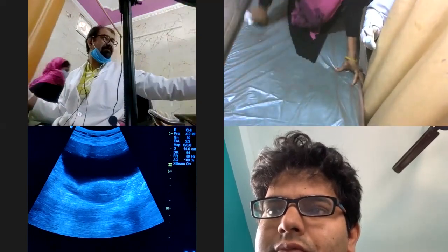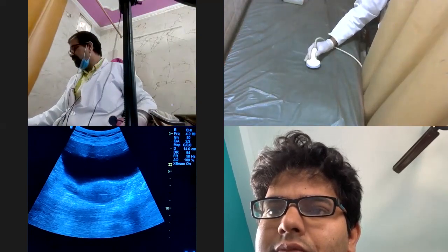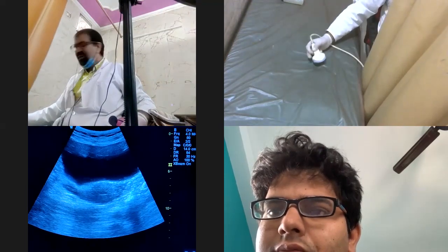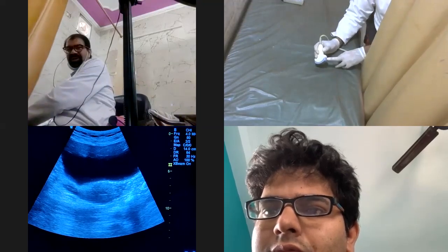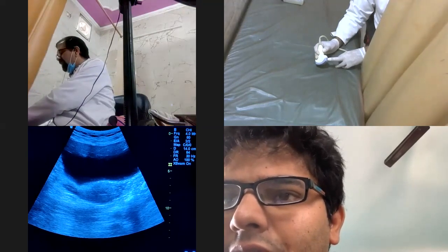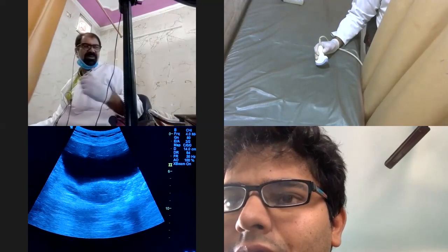Manjeet, hold on. Whether to put the probe this way or the other way will be decided by the marker which is over here. Which is the marker? Yes, sir. This marker should be towards the patient's right. Clear? Yes, sir.